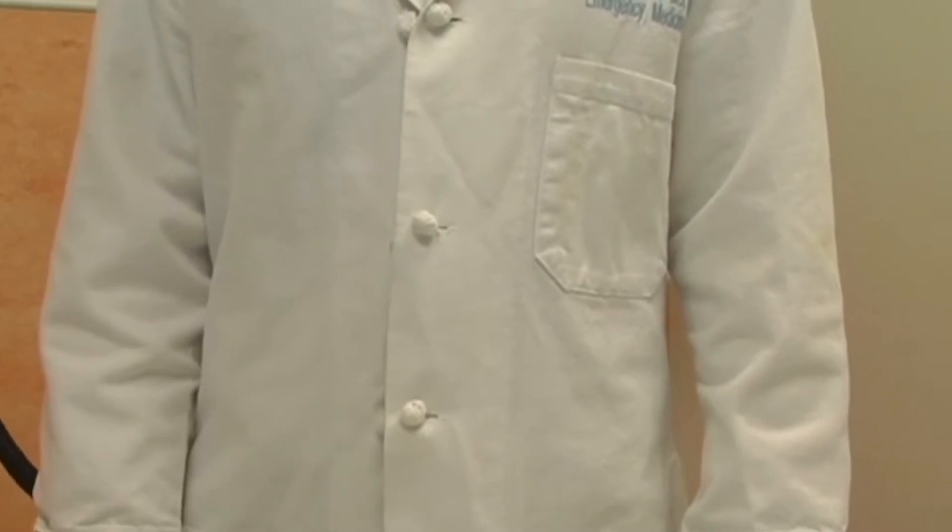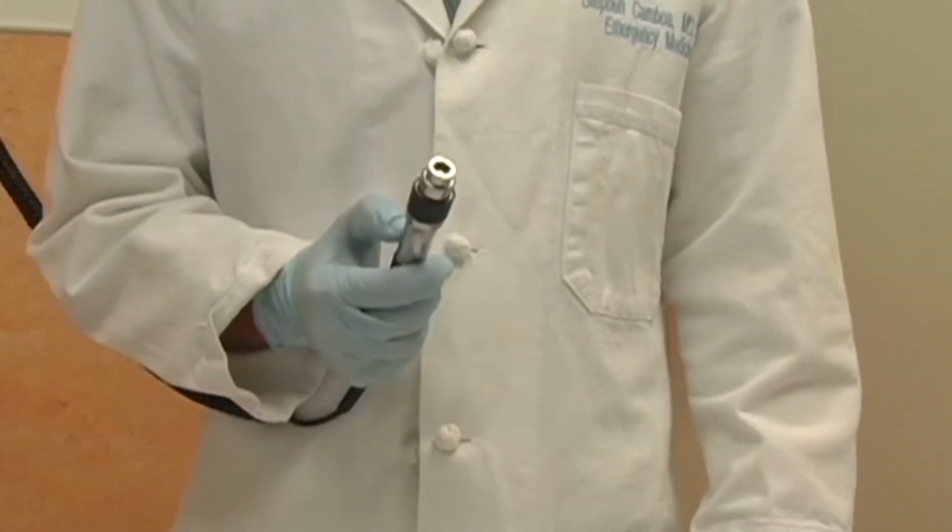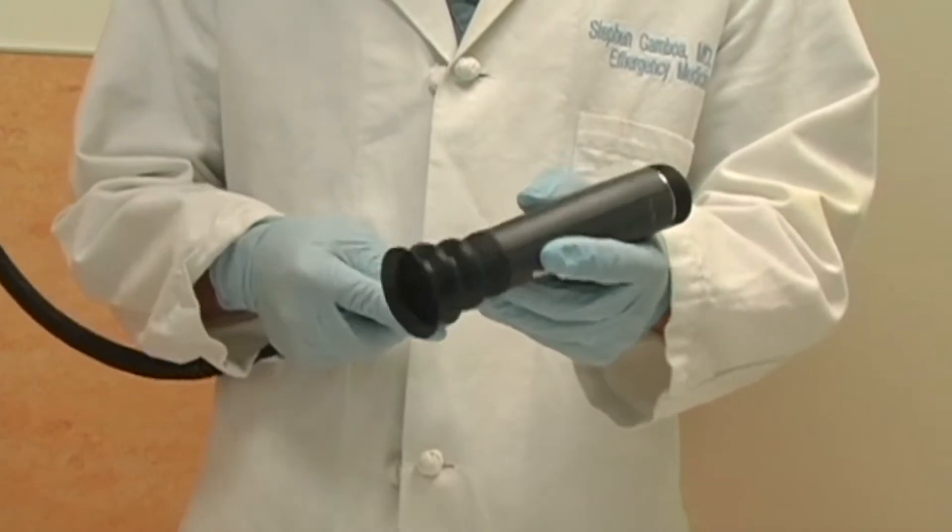You will need the following equipment: the standard Welsh-Allen diagnostic handle and the Panoptic device itself.